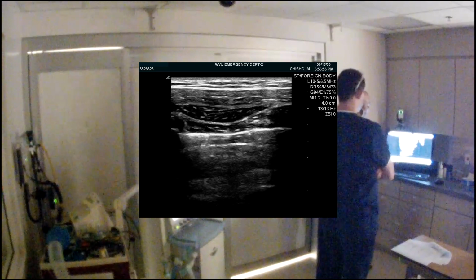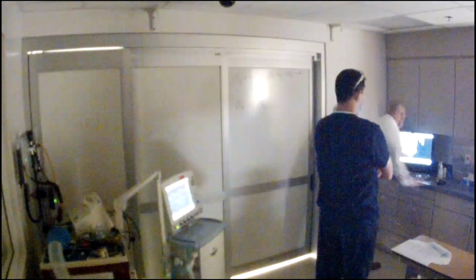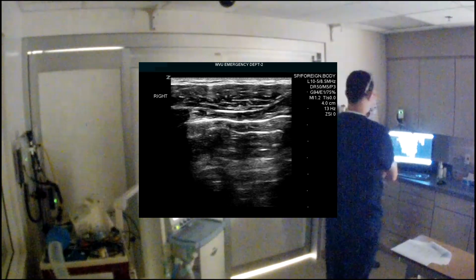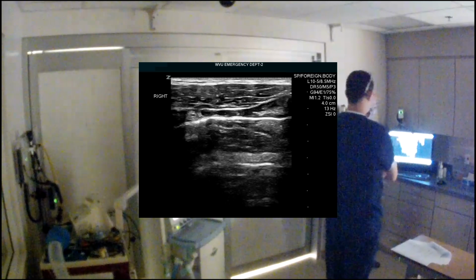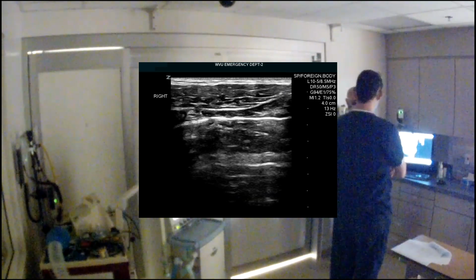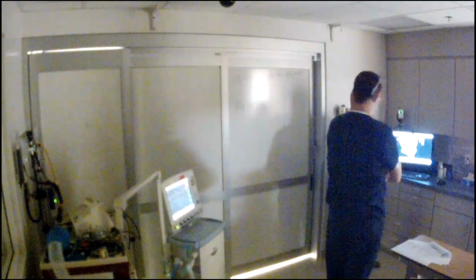So now let's contrast that with absent sliding. We look at both lungs. Here, there's a rib. There's a rib. Here's the pleura, or what should be the pleura. Nothing. See how there's no sliding? This is a pneumo. No listening required. This is actually far more accurate both for ET tube placement and for diagnosing a dropped lung than auscultation. So how do you know if your ET tube's in the right place?